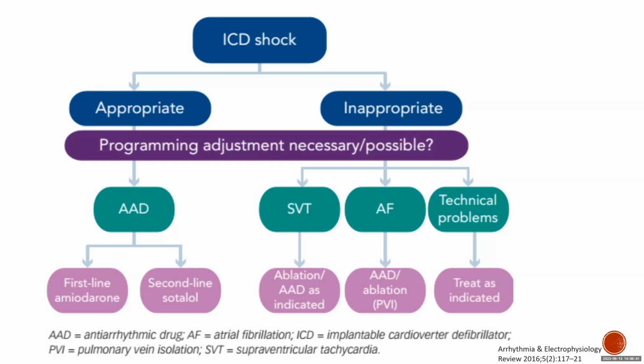So what I would say is most of the time, the patients in the CCU and receiving multiple shocks, it's almost always better to put a magnet or reprogram the device and you control the situation rather than letting the device do that.